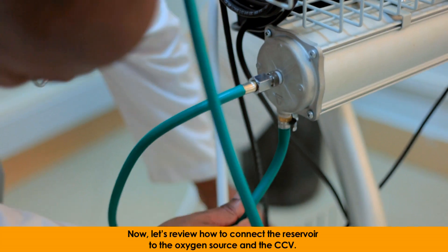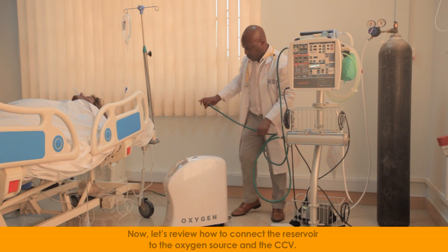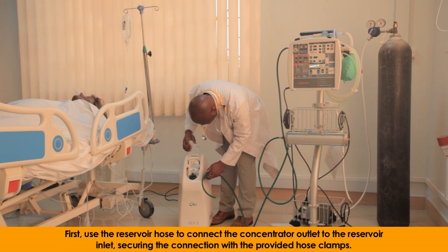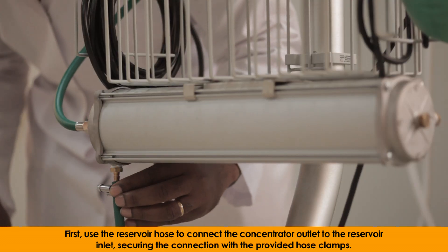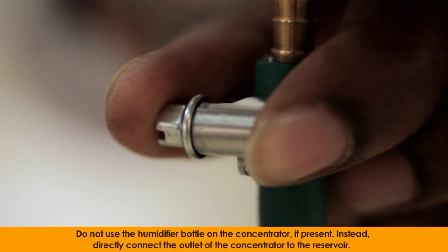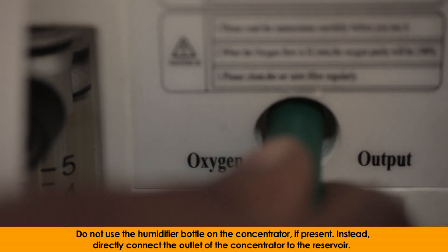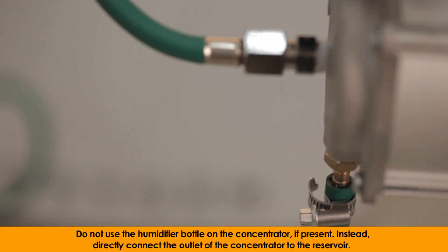Now, let's review how to connect the reservoir to the oxygen source and the CCV. First, use the reservoir hose to connect the concentrator outlet to the reservoir inlet, securing the connection with the provided hose clamps. Do not use the humidifier bottle on the concentrator if present. Instead, directly connect the outlet of the concentrator to the reservoir.